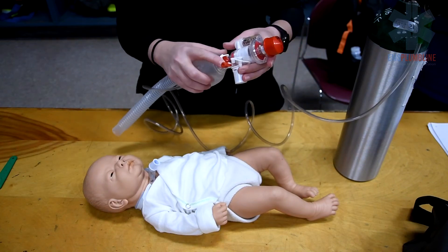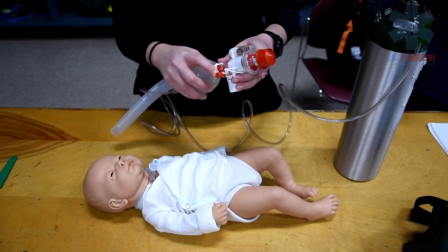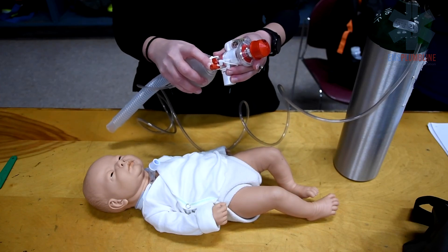When bagging a ventilator-dependent child, the Ballard suction can remain in place to allow for easier suctioning while bagging.